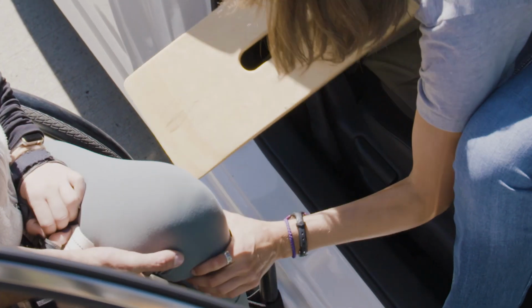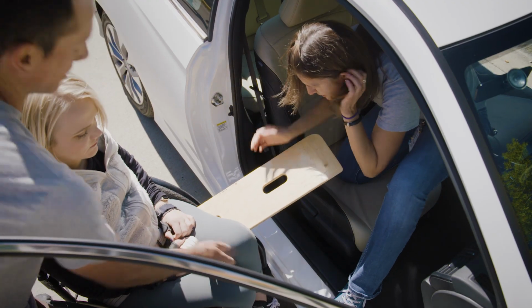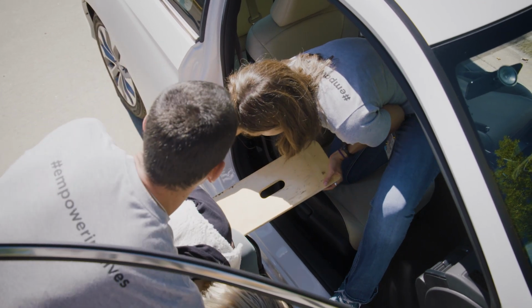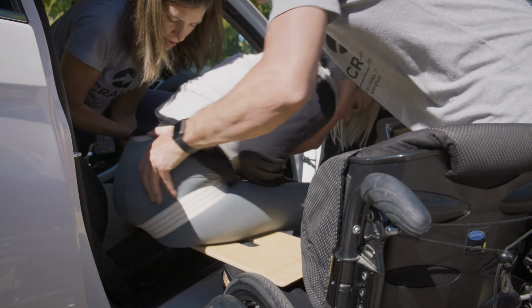One assistant will help from the car seat. The transfer board should be placed under the thigh. The other assistant will help from outside the car, supporting the head and hips. Leaning the passenger forward will ensure the hips will easily glide across the board. The hips will lead the motion onto the car seat.